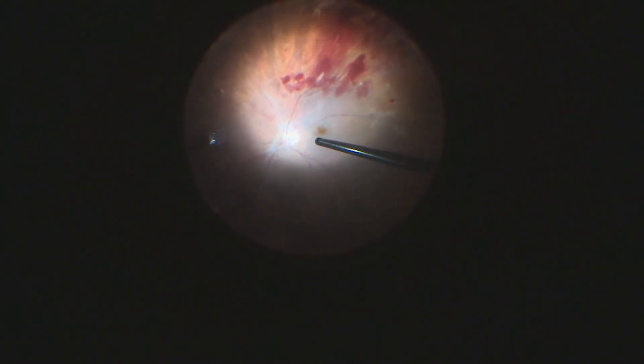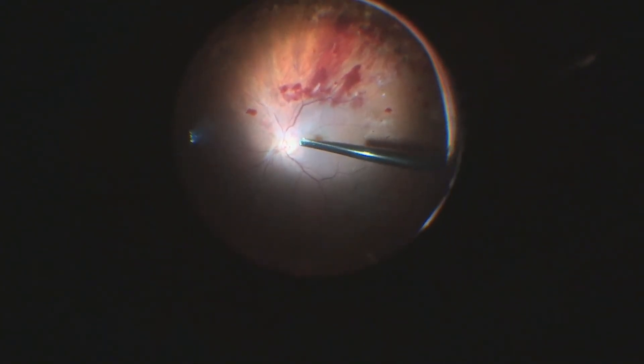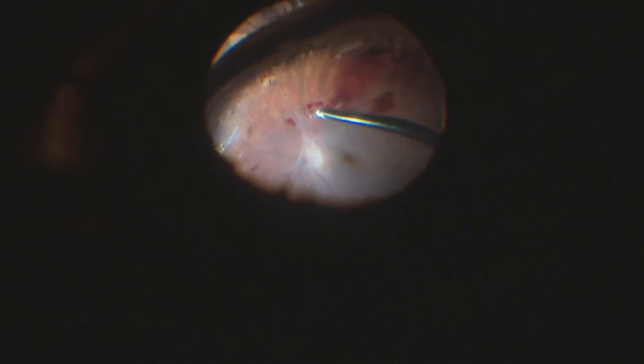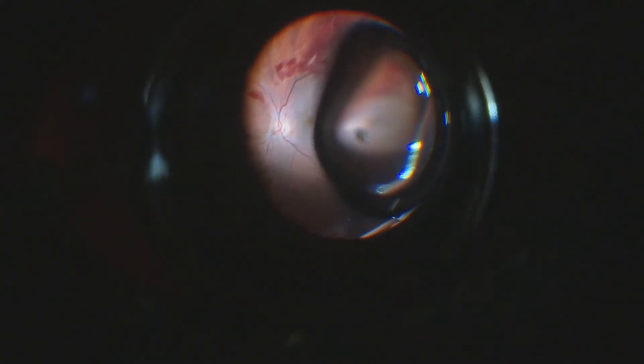Now we'll start the fluid gas exchange. We'll run into a little trouble — there'll be a small bubble of air that will migrate to the anterior chamber, and that'll make our life a little harder. There she comes — and there she is.